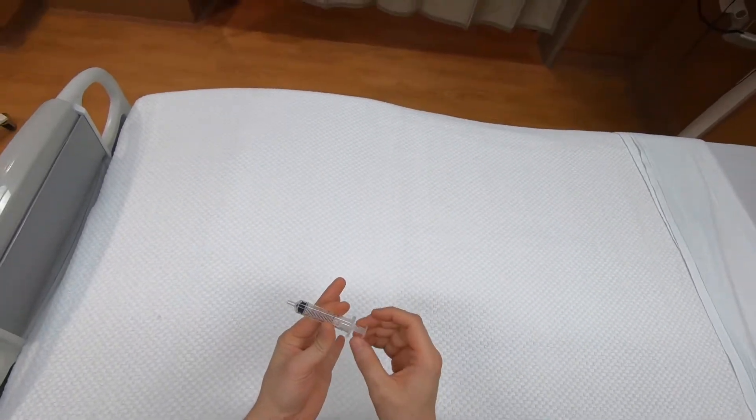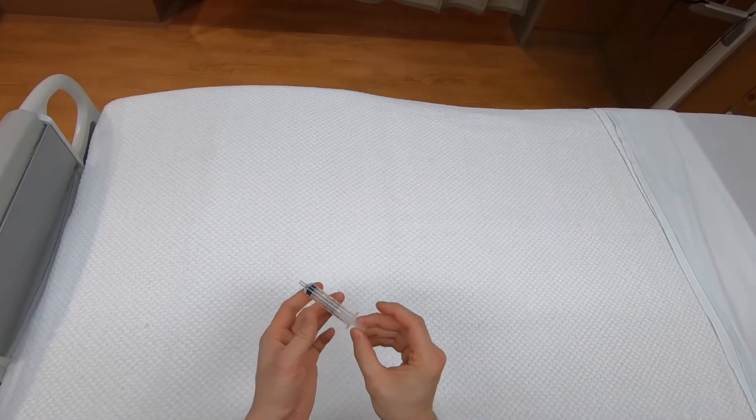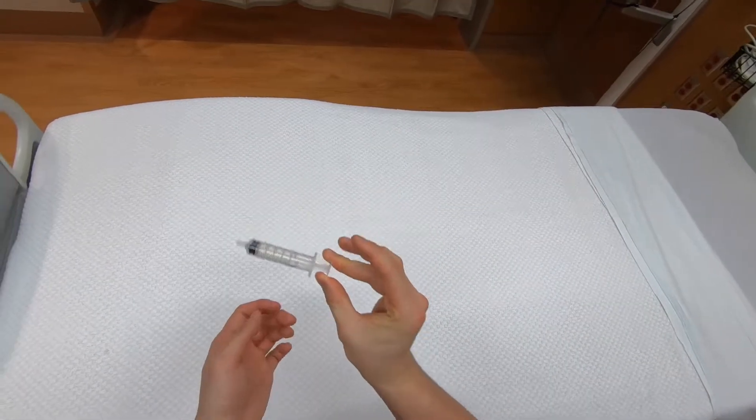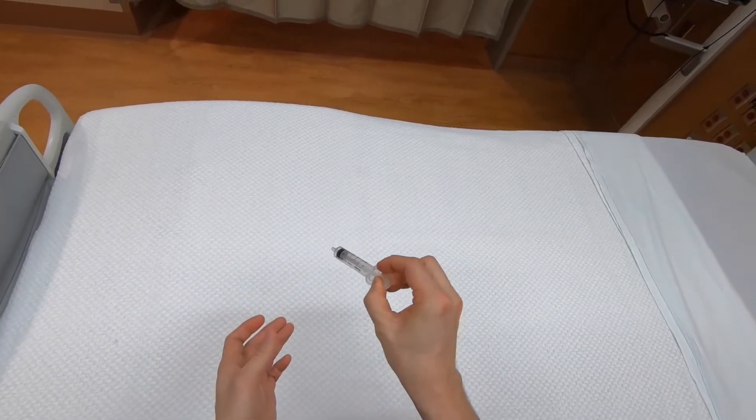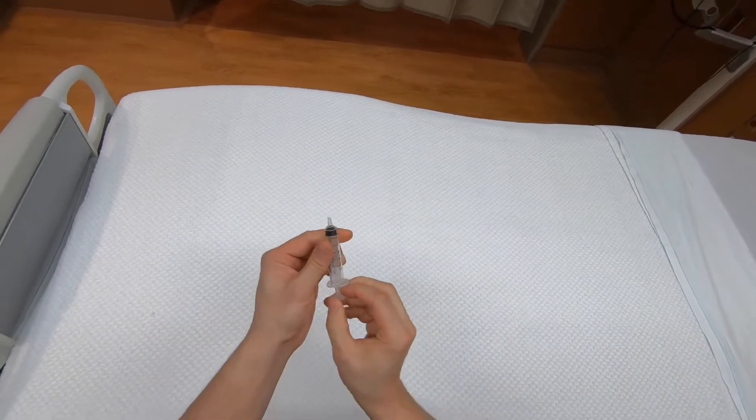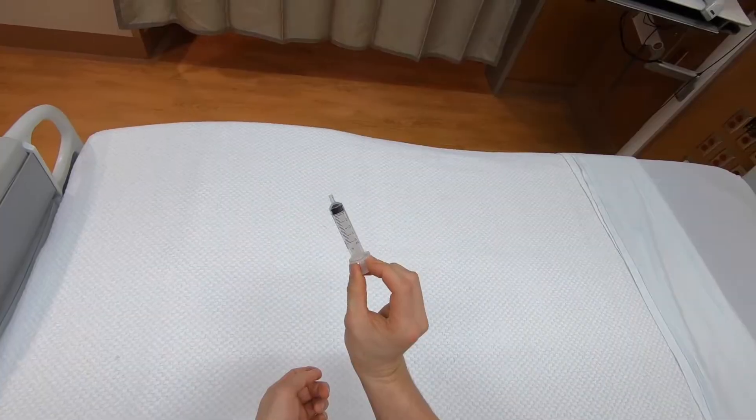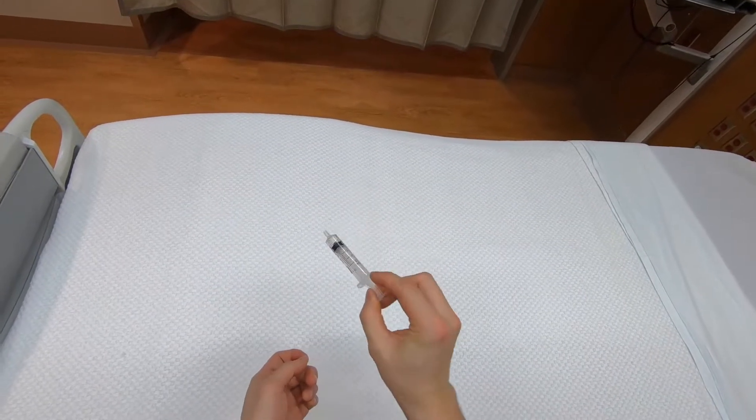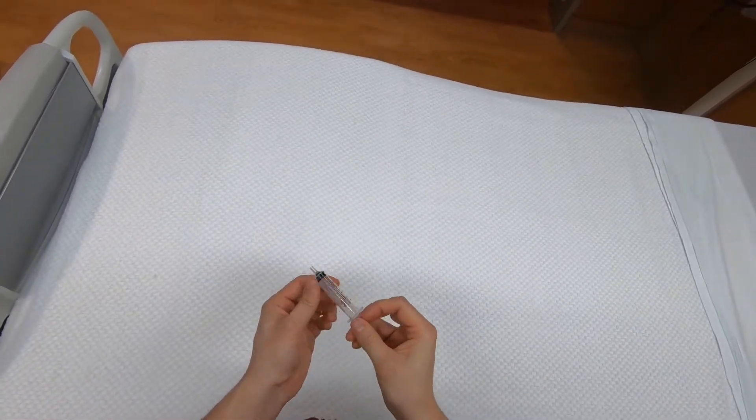There are two, perhaps three, grips that are most useful. The first is to hold the plunger with your thumb and middle finger as you press against the flange of the syringe with your index finger, like this.